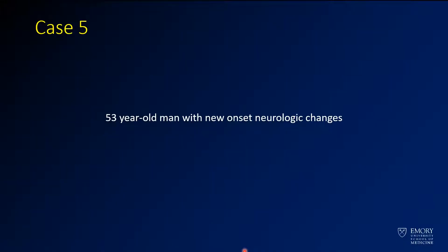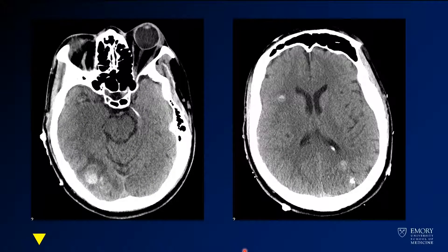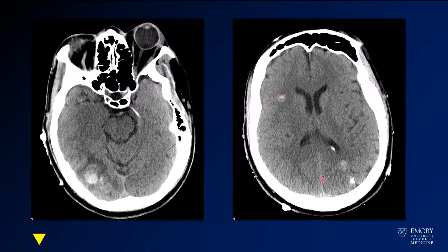Case 5 is a 53-year-old man with new neurologic changes. Here we have a couple of images from an axial CT through several different levels. You've got an area of hyperintensity here in the right occipital lobe, another one in the right deep frontal white matter, another one in the left occipital region, and here you've got something that looks kind of bright as well.